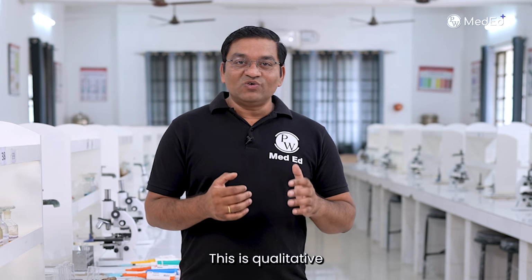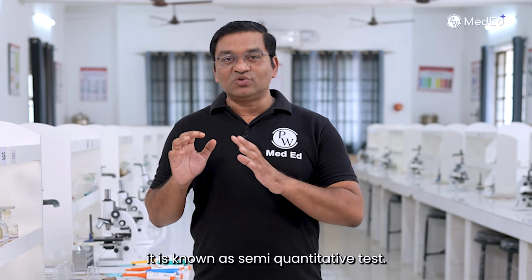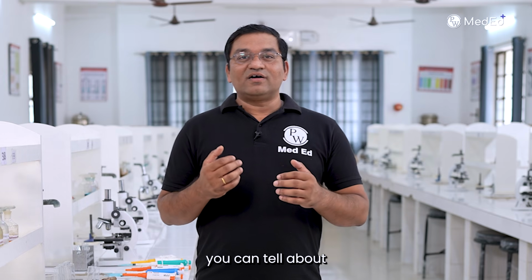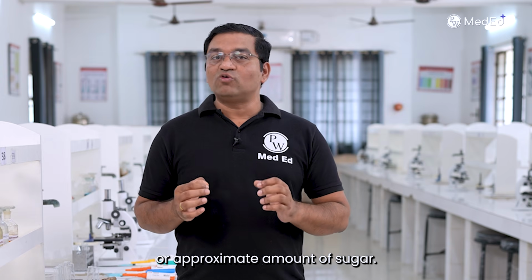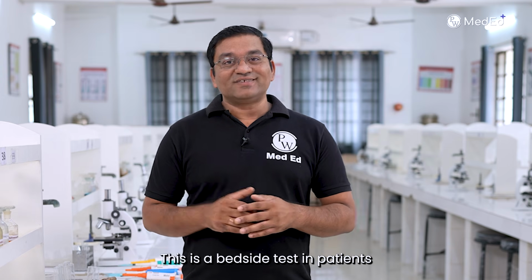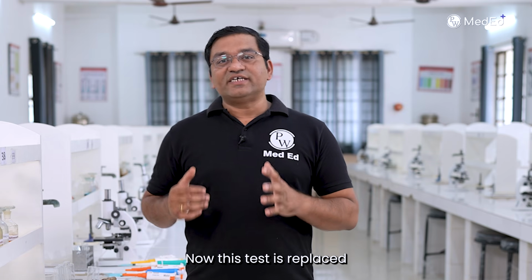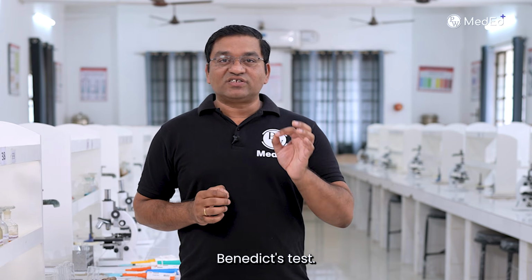This is qualitative as well as quantitative test, that's why it is known as semi-quantitative test. Depending upon the color formed, you can tell about the approximate amount of glucose, or reducing sugar, present in the urine sample. This is a bedside test in patient with diabetes mellitus. Now this test is replaced by the dipstick method, but Benedict's test is still done in the laboratory.